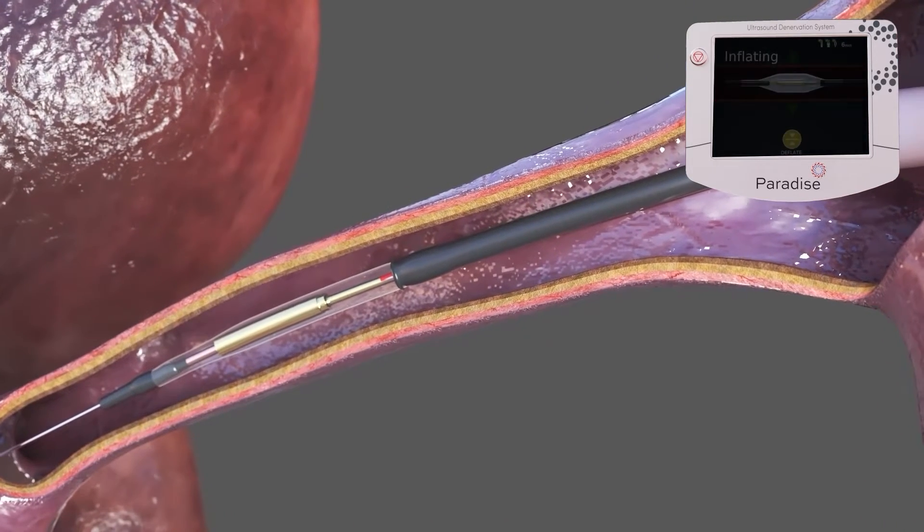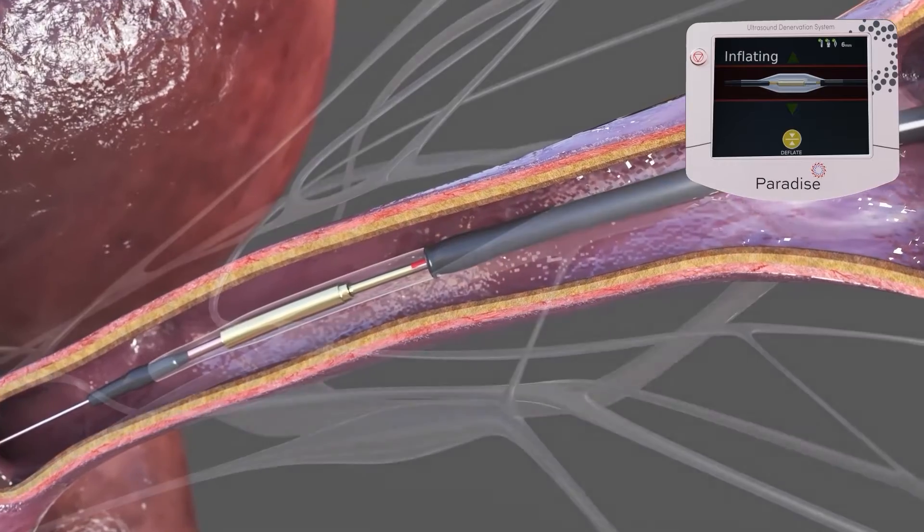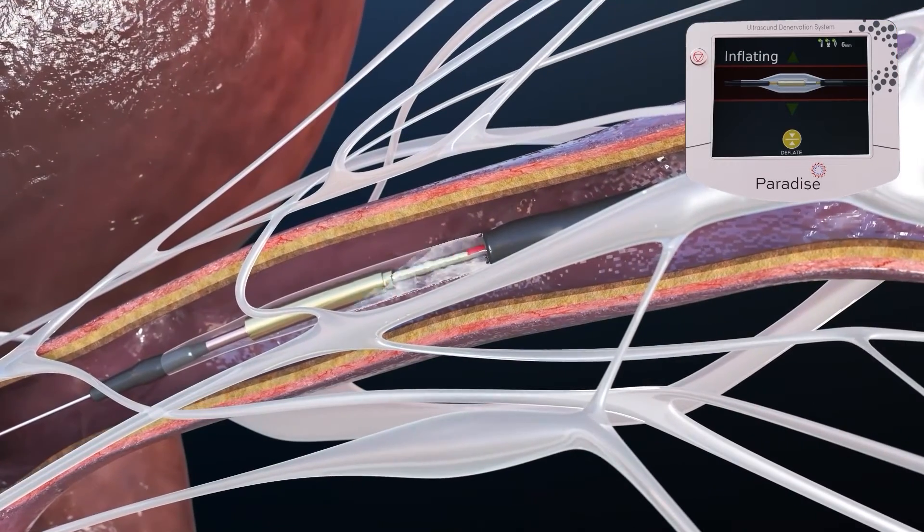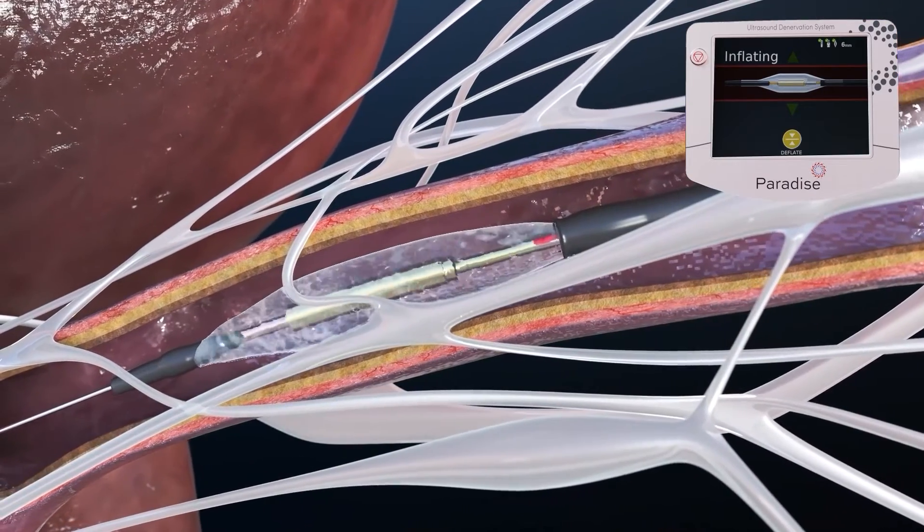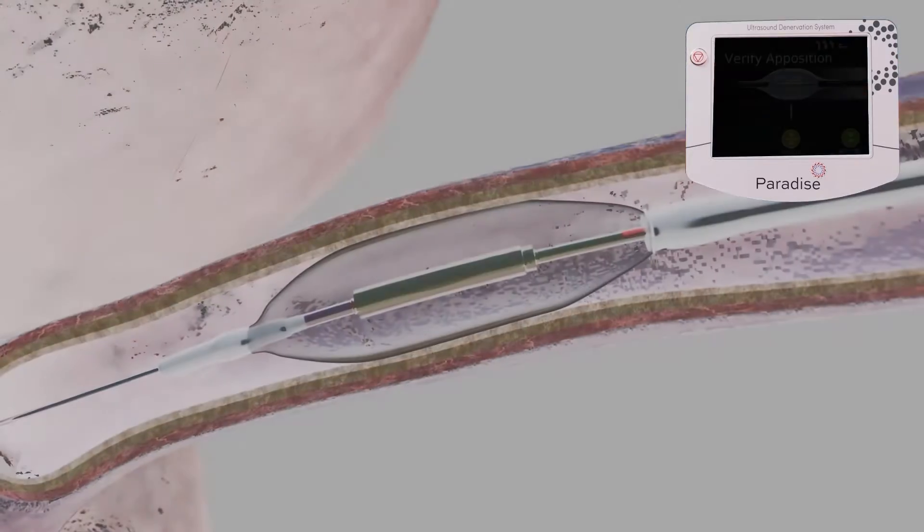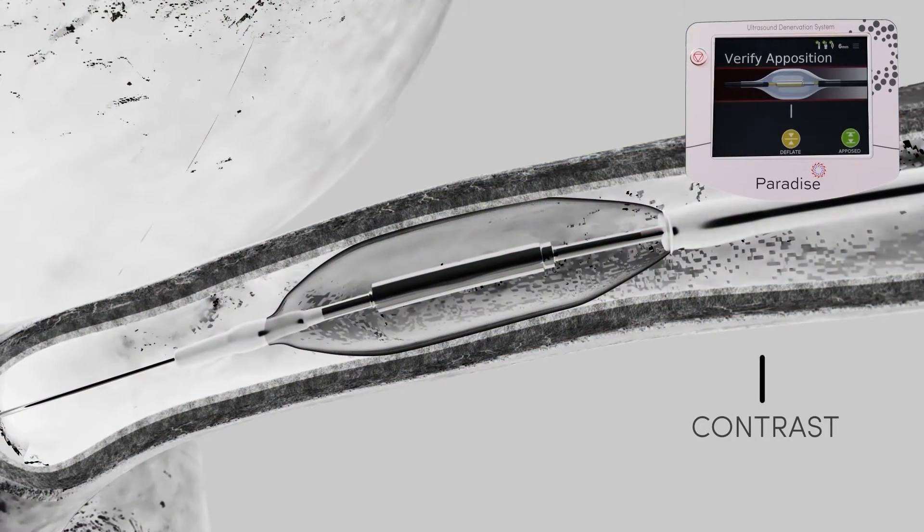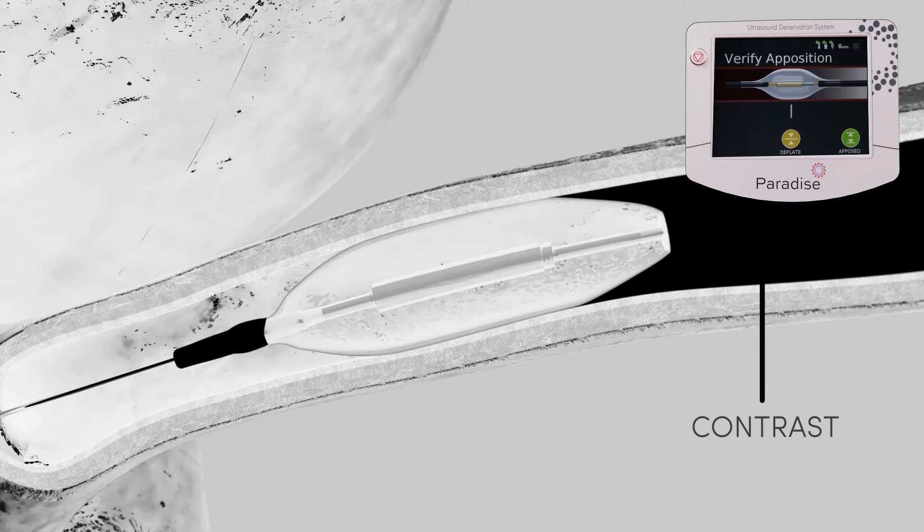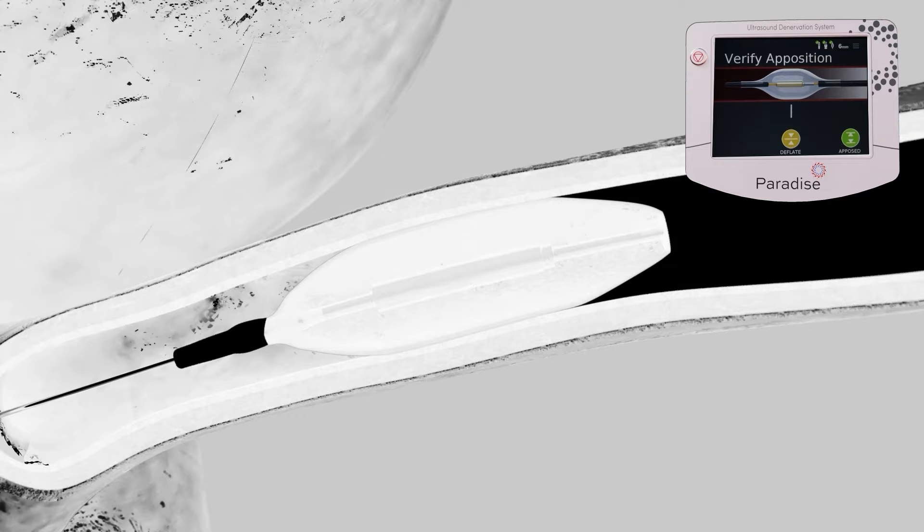After the catheter is placed, the balloon is inflated with constant low pressure managed by the generator. The controlled pressure allows the balloon to gently contact the vessel wall, centering the ultrasound transducer in the artery. Apposition of the catheter is confirmed with a small amount of contrast fluid.